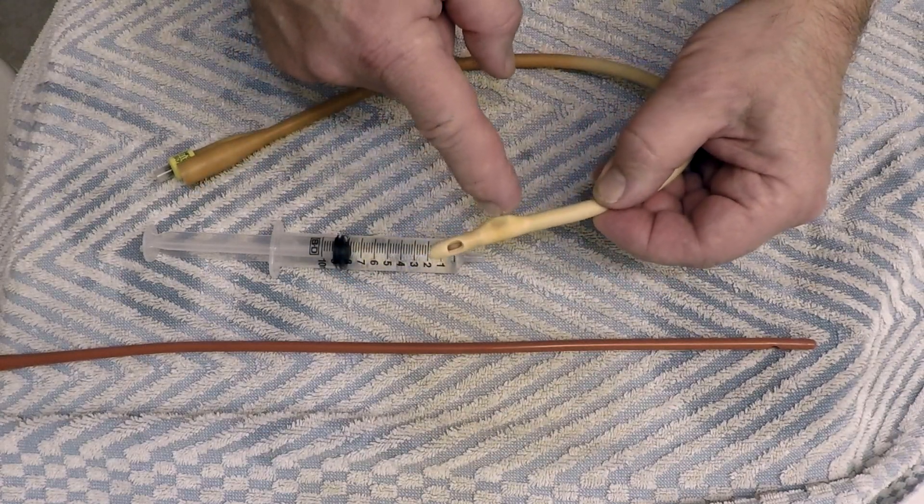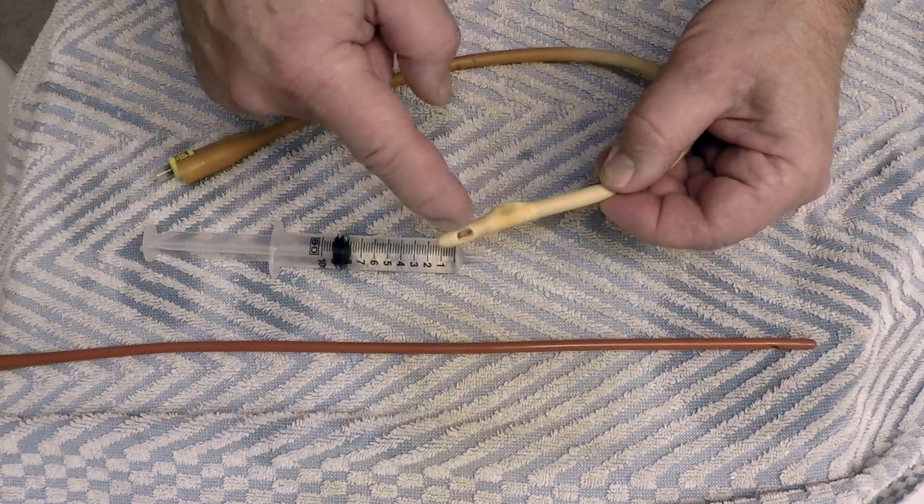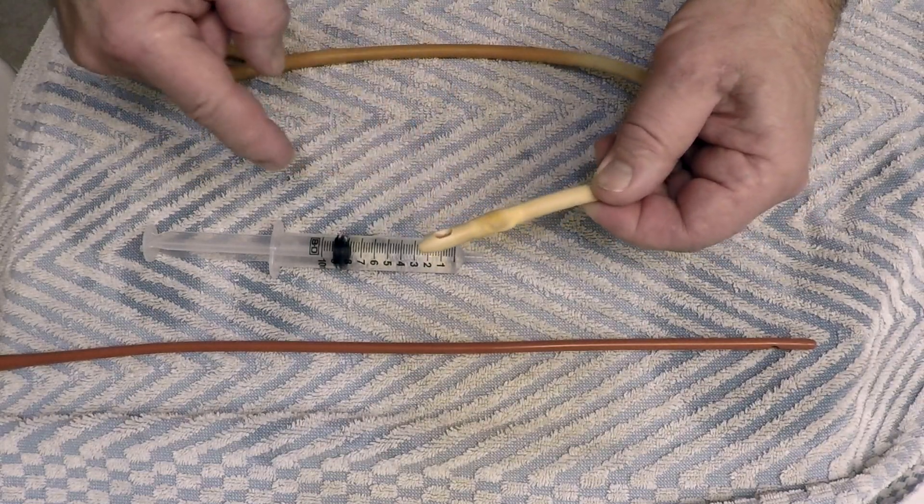You can see the bulb on the end here that goes into your bladder and then the two holes that drain the bladder.